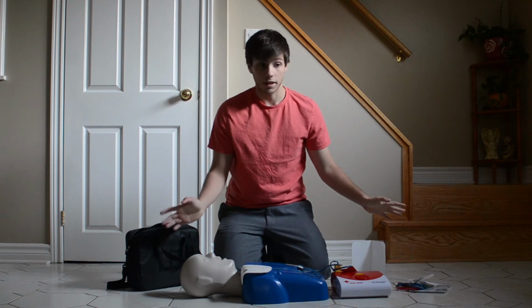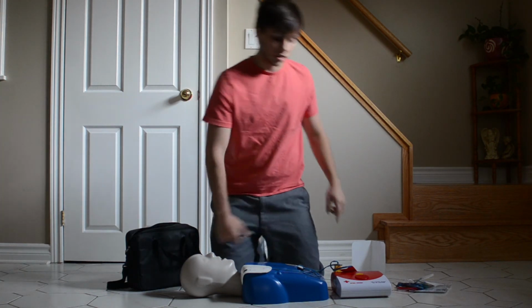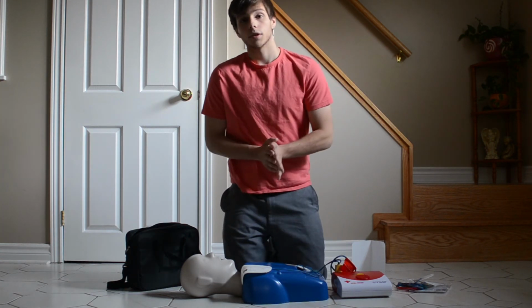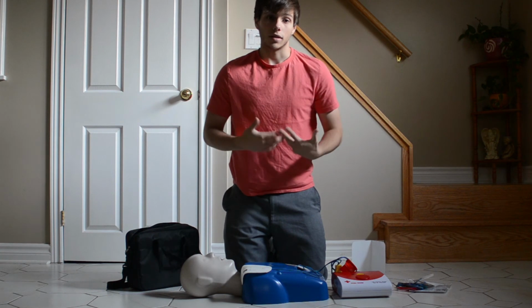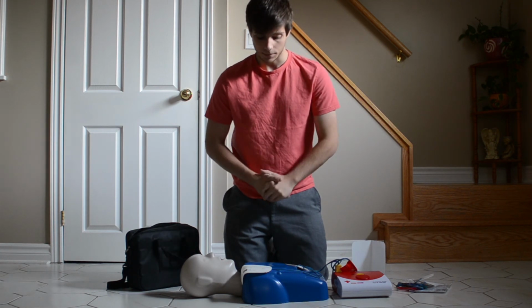So you want to say, everybody clear, everybody away. As soon as you can confirm nobody is directly touching the patient, you can administer the shock, which will be indicated by a flashing button. The shock will administer, there'll be a little bit of a convulsion, and then you can get back on CPR until the AED tells you not to. This AED is going to stay open and working for a couple of checks, so as many as you need to use it.